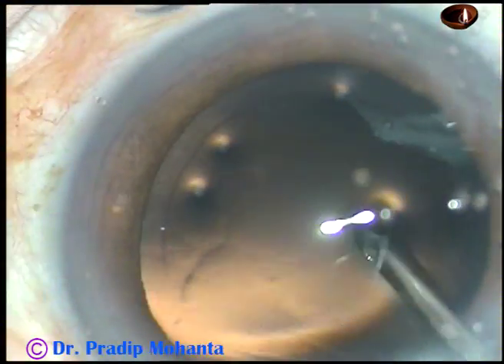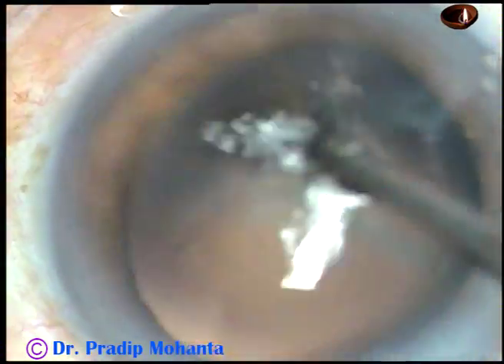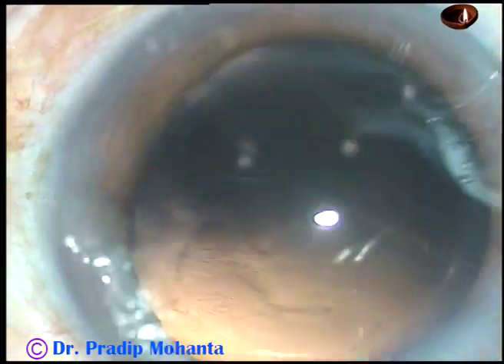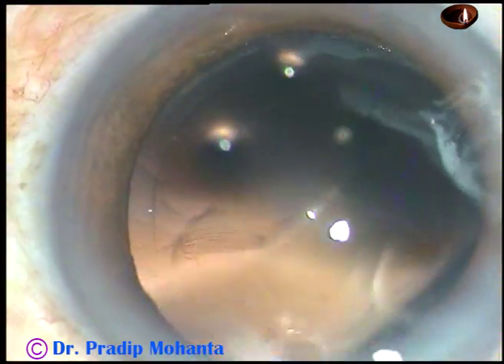A little bit of polishing has been done with the Simcoe, and now this is hydro polish — the irrigating jet of fluid is being used to polish the posterior capsule.